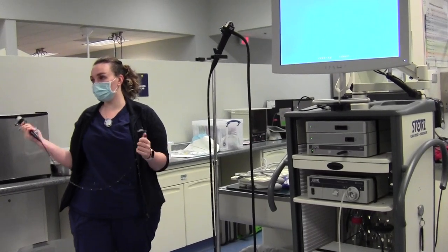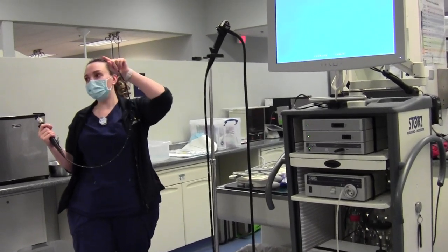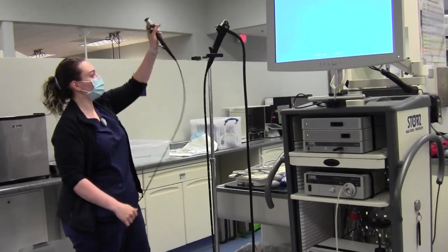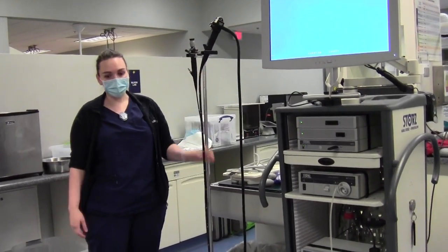It's more suitable for exotics because their pets are so small. We'll also use this to look at behind the nose — retroflex rhinoscopy. This has a different hookup which will obviously differ from our gastroscope and the colonoscope.